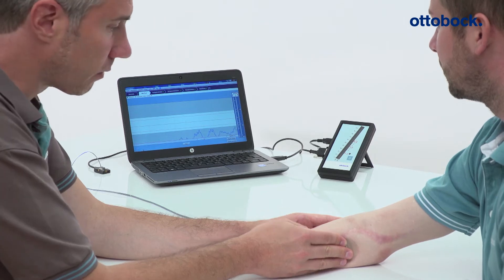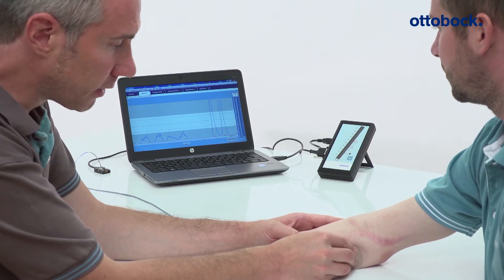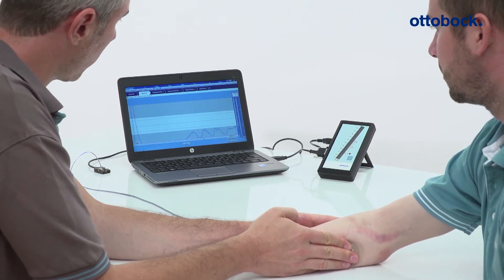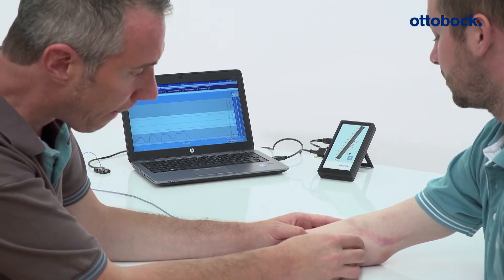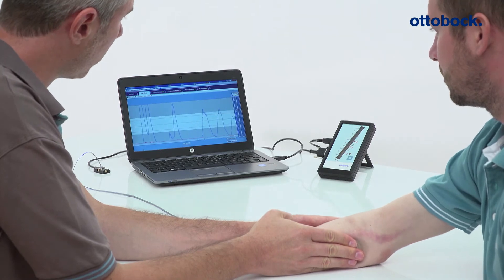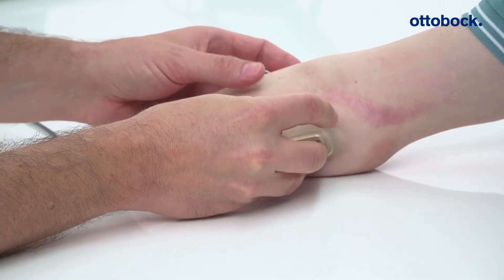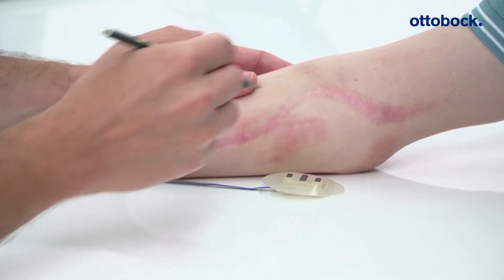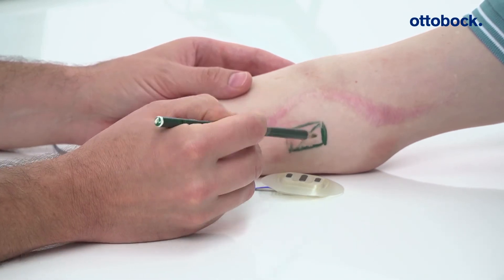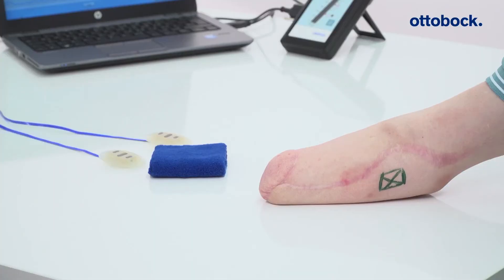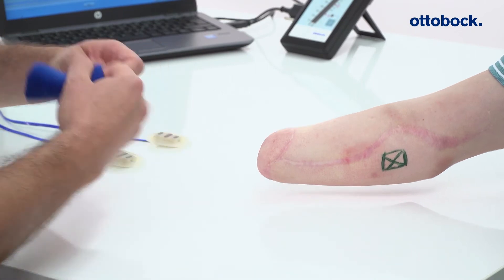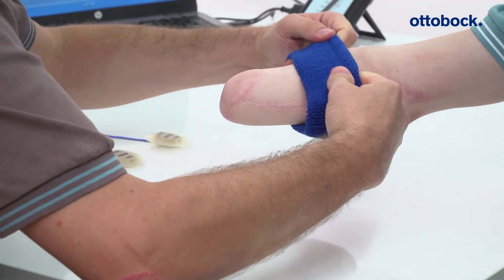To define the optimal electrode position, check the MYO signal with Paula software. The exact position of the strongest MYO signal can be determined by moving the electrode around the region and testing the signal at each location. Mark the optimal electrode position on the skin. Determine the optimal electrode position on the antagonist muscle group, in this example the forearm extensors, by performing the same process as described above.